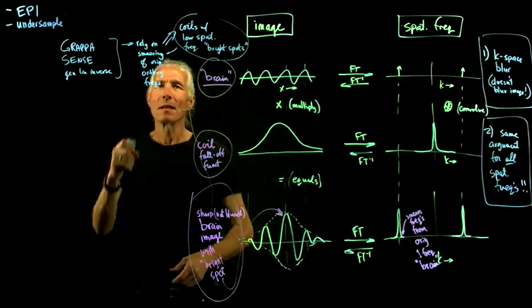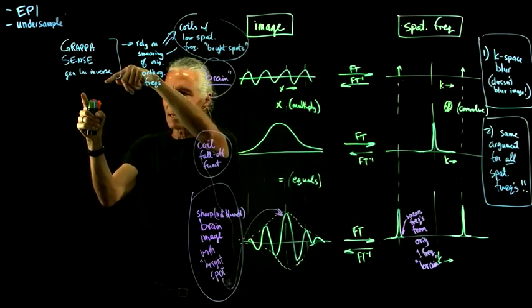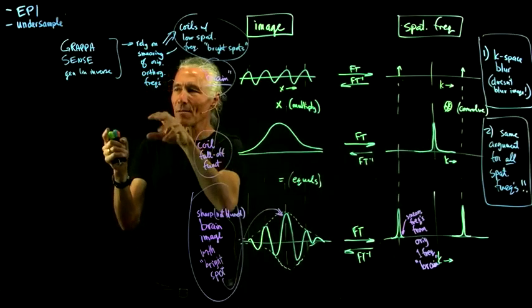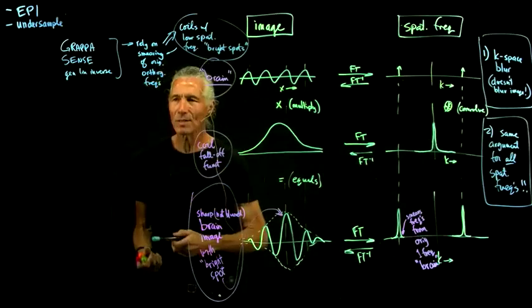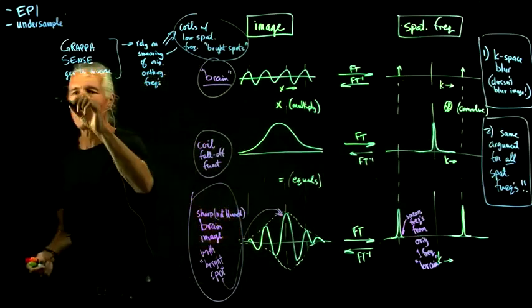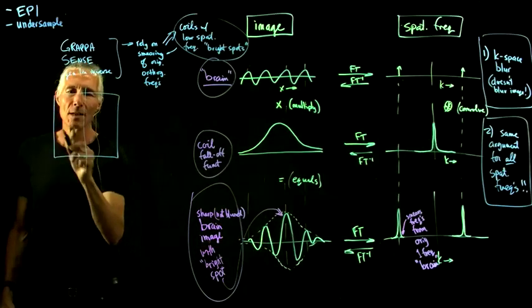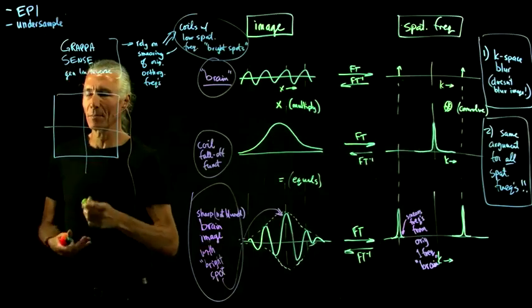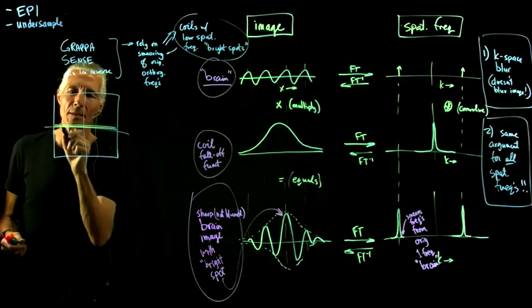And because of that, we can do these reconstruction methods that rely on the fact that the signal has been smeared out to the surrounding frequencies, so there's some information in the surrounding ones. And how do you do this? We'll just give the example for GRAPPA. How you do it is you first record all the lines of K-space in the middle.